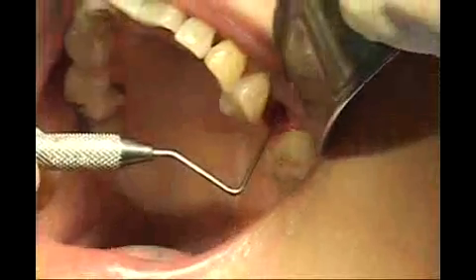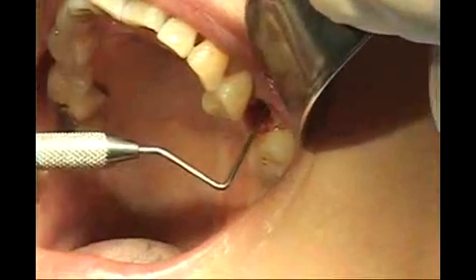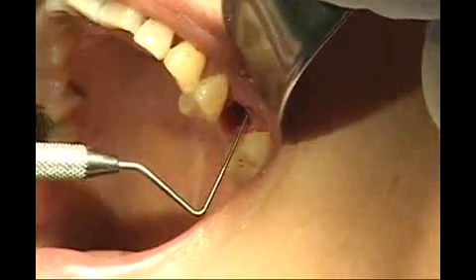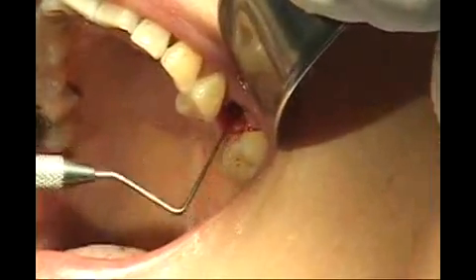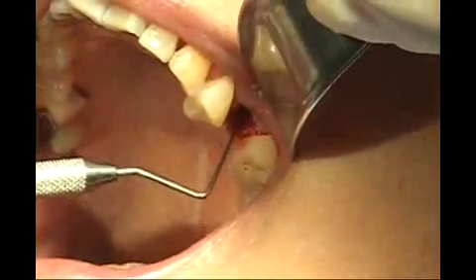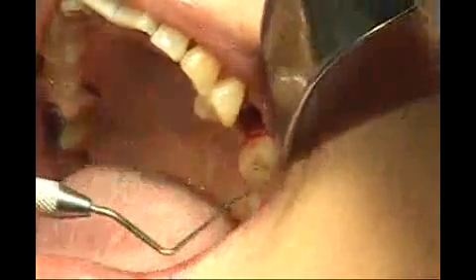And if you want, you can also measure with a probe, just to make sure that we're at least 3 millimeters from the tissue, which we are. Okay, so I know that the buccal has a little space on it. The mesial and the distal are fully covered by the implant, and the palatal is fully covered by the implant. So now the option whether to graft it or not.